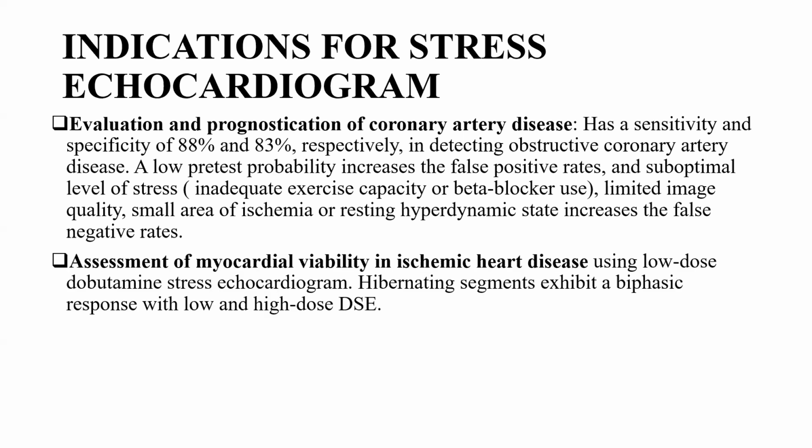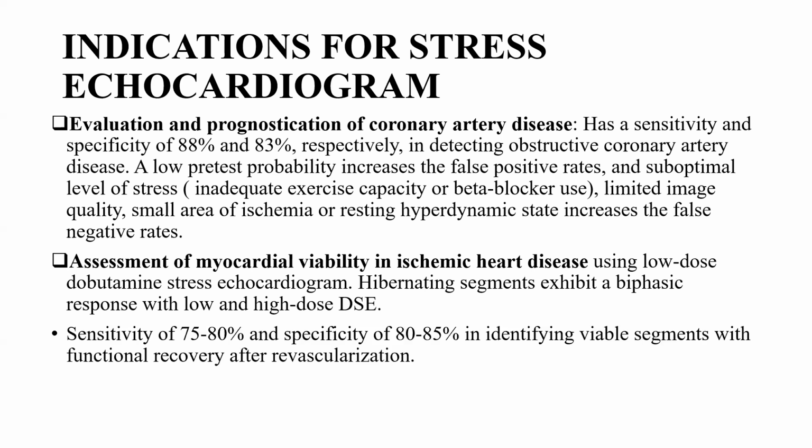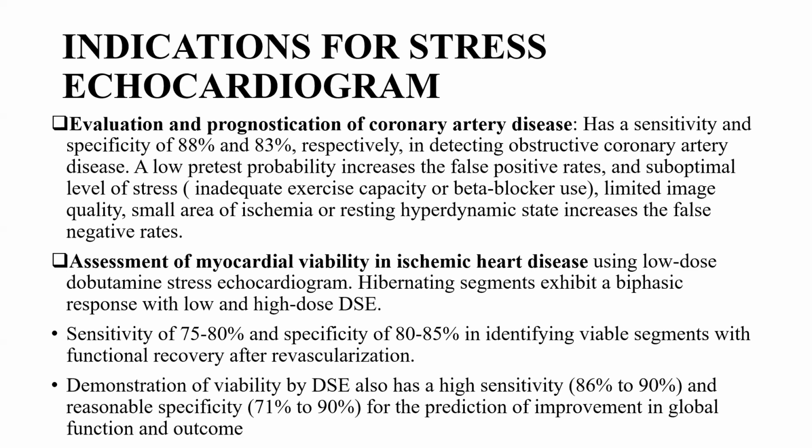For myocardial viability, so for hibernating segments where you are assessing viability, the low dose dobutamine stress test is helpful in assessing viability in an area that has ischemia. And the sensitivity is 75 to 80%, and specificity is 80 to 85% in identifying viable segments with functional recovery after revascularization.